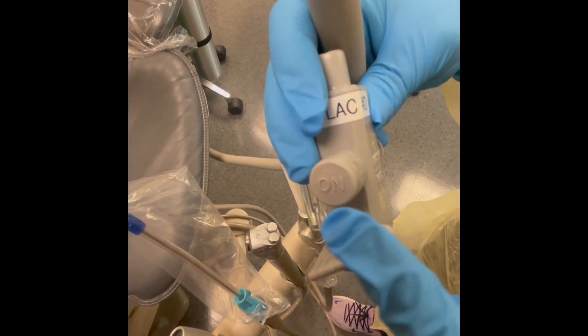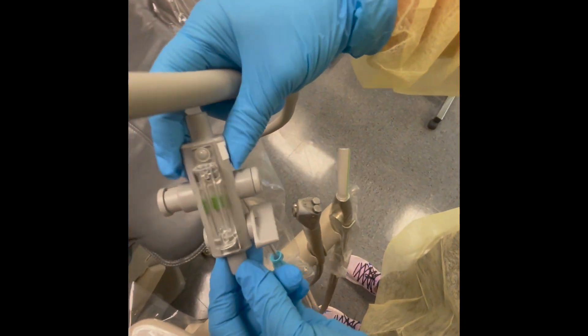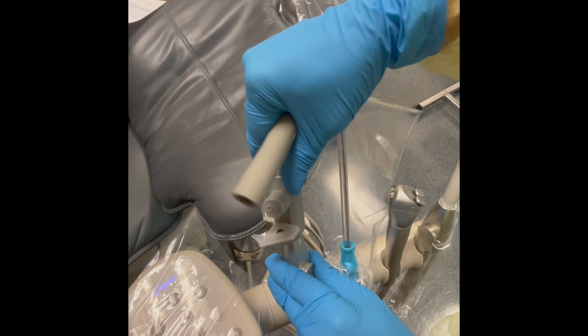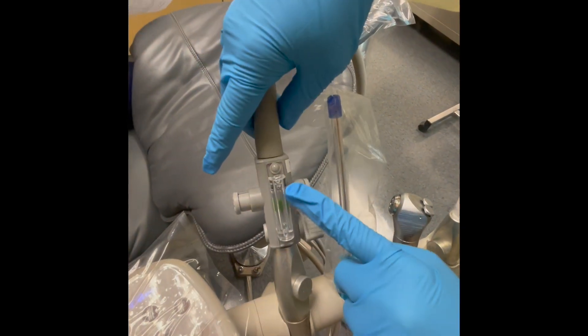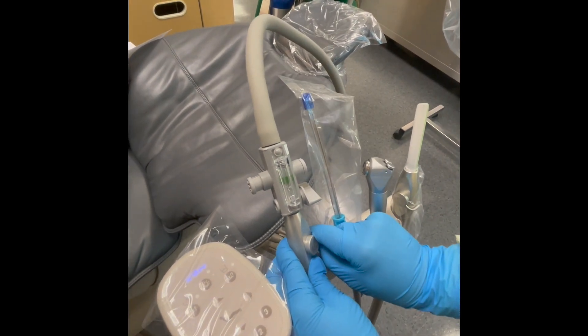Assemble the scavenging and evacuation system. It has arrows directing you which end goes where — make sure to turn it on. Adjust it so that it is at the ideal level of 45 liters per minute. You'll know it's at this level when the sphere is in the green zone.